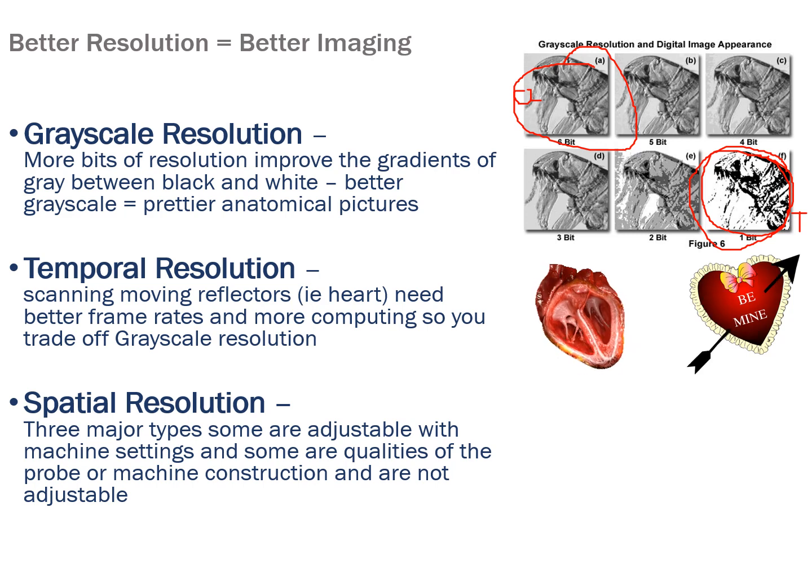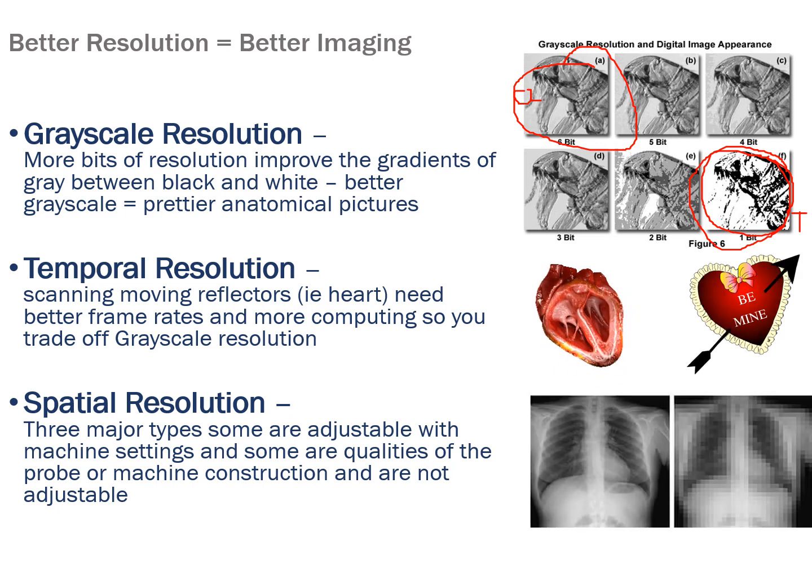Temporal resolution. This one is moving fluid in and out of the beating heart with quite good temporal resolution. But this is very low temporal resolution, not much detail, very simple movements.